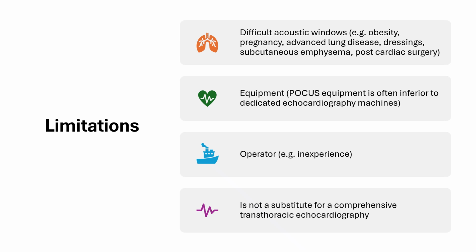Equipment is often inferior to dedicated echocardiography machines used by our cardiology colleagues, so you're limited by the amount of fancy calculations and measurements you can do. There's a possibility of operator inexperience, and also POCUS is not a substitute for a comprehensive transthoracic exam.